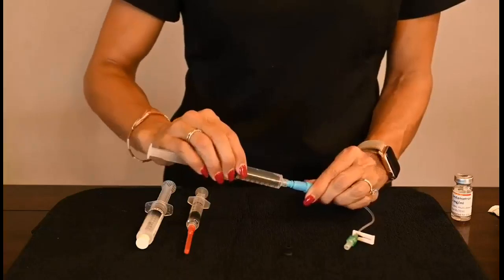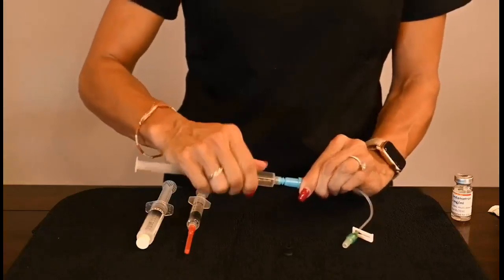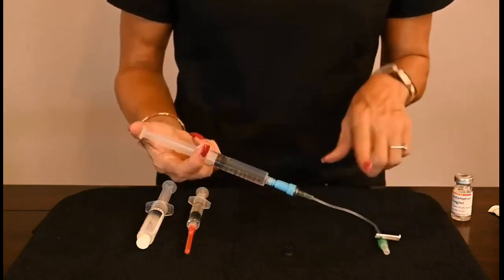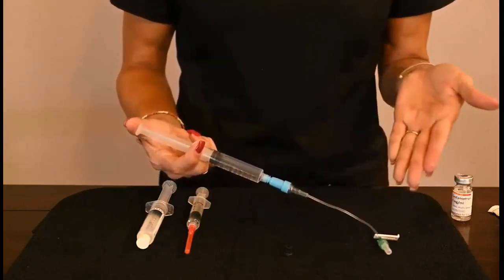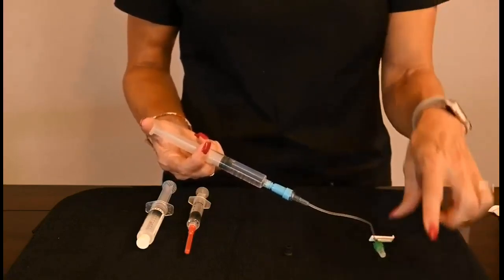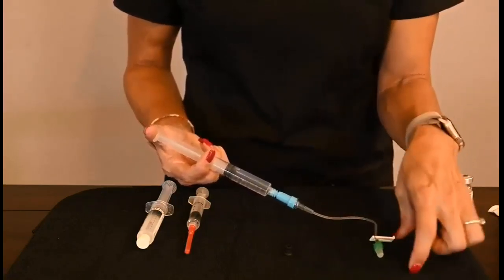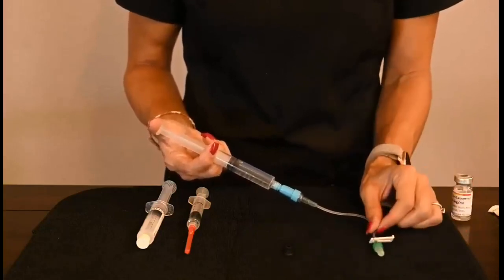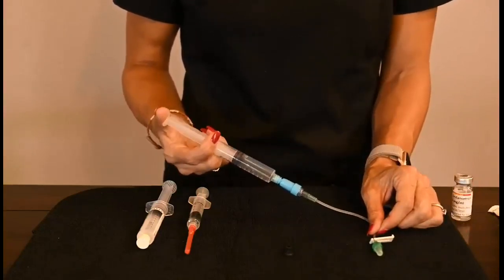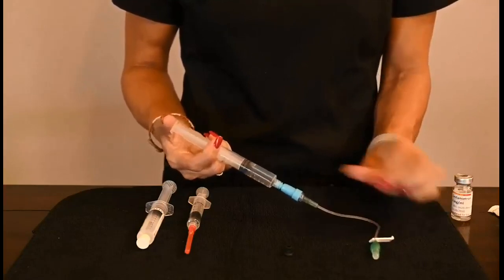Now let's remember, why are we doing a flush prior to administering medication? Well, we're doing it because we want to make sure that the vein is still patent. So I would flush, and as I'm flushing, I would be looking at the vein, looking to see if there's any kind of infiltration or phlebitis, asking the patient if they have any pain during that time. I'm going to push pause 3 to 5 mLs of the normal saline.